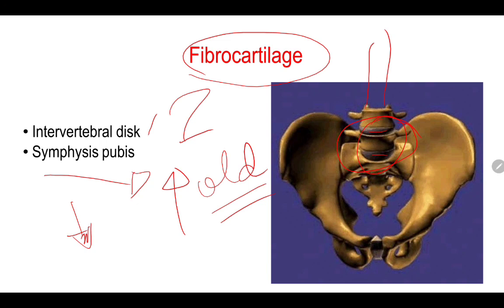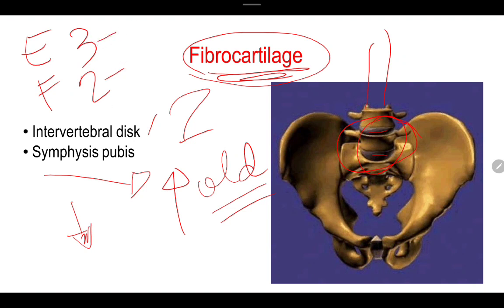Okay? So, based on the topics na na-discuss ko sa inyo, let's identify. I challenge you to identify the type of cartilage present. Okay? So, share ko lang ha. For the elastic, you have 3. Diba? We have the auricle of the ear, epiglottis, and the eustachian tube. For the fibrocartilage, you have 2. Intervertebral disc, and the symphysis pubis. So, the rest, na hindi included dito sa kanilang dalawa, is already hyaline cartilage. Ganun lang. Kung hindi included dito, hyaline yan. Okay? So, let's start.